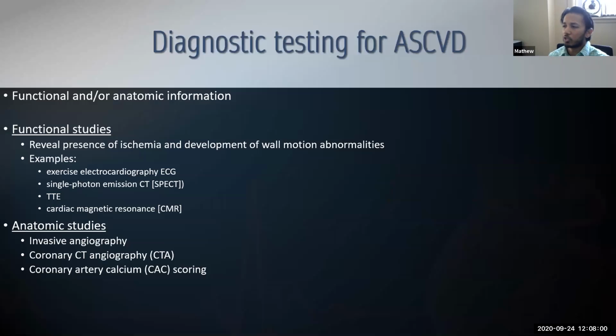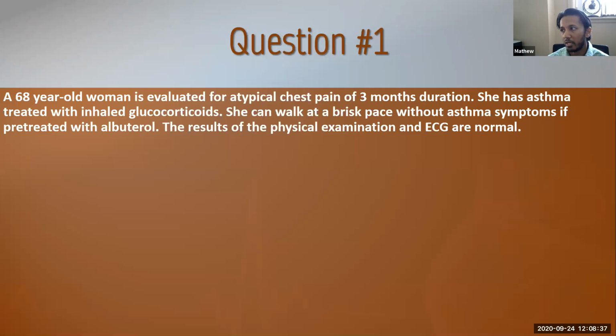So if we look at the functional, it's going to allow us to see, is there any evidence of ischemia before we even get into the anatomic look of the heart? And this is how we get this through ECGs, right? That's not going to, it might help us localize, which I'll get to in my EKG talk, but it's really just telling you if there is an underlying issue going on with the heart itself. Even the SPECT CTs and the echocardiograms that we get, it's giving you the overall function, not as much of the anatomy as we would like. But if we're thinking of anatomic issues, looking for underlying ischemia, obstruction, et cetera, that's where we're doing the CTAs or coronary calcium scorings and obviously invasive coronary angio.